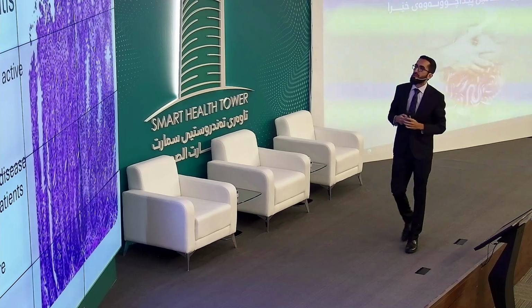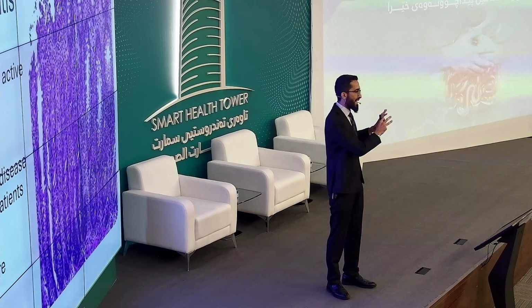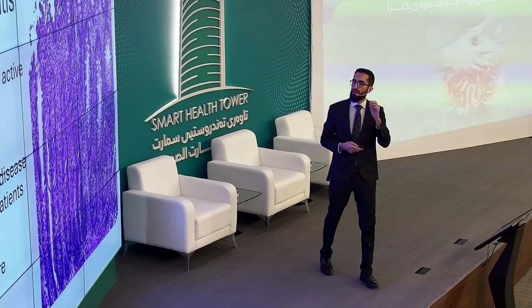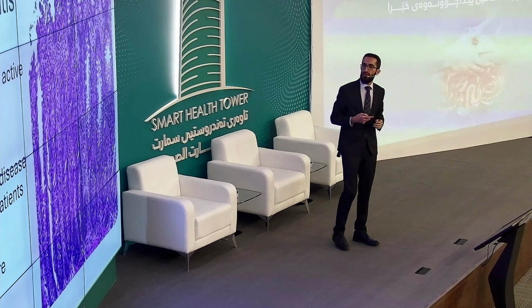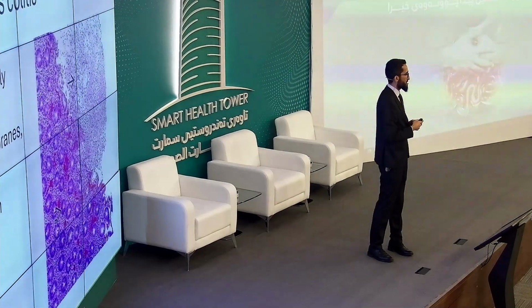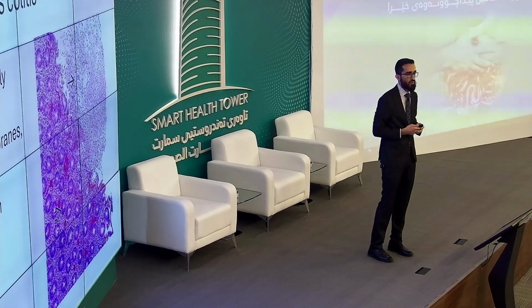Okay, let's skip this. Acute infectious colitis has a different histology. It's only active disease. We don't have the chronic changes that we mentioned. But it's important to do stool culture and serology for these. Pseudomembranous colitis, you shouldn't be doing an endoscopy for a patient with pseudomembranous colitis to begin with. You should be diagnosing it clinically and with stool tests.